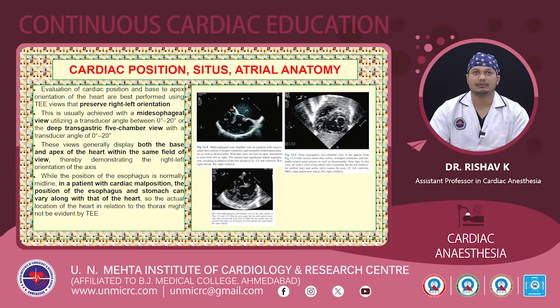Now coming to the start of the examination. Firstly we will be looking at the cardiac position, the situs and the atrial anatomy. At first we will start with a view that we are all very familiar with, and that can serve as a home view. We can start the examination from the home view, and then proceed. Suppose the echocardiographer gets lost and the desired views cannot be displayed accurately, then we can always come back to this home view. In this case, the home view will be the mid-esophageal 4-chamber view.